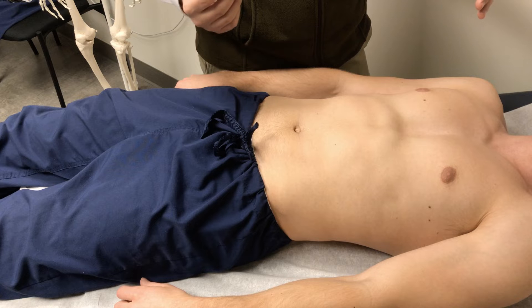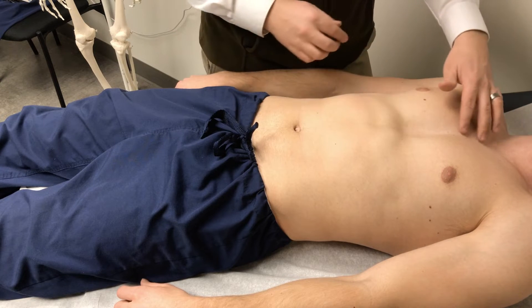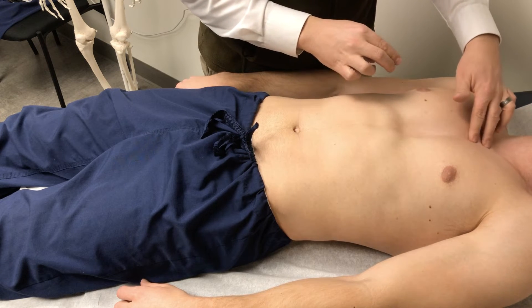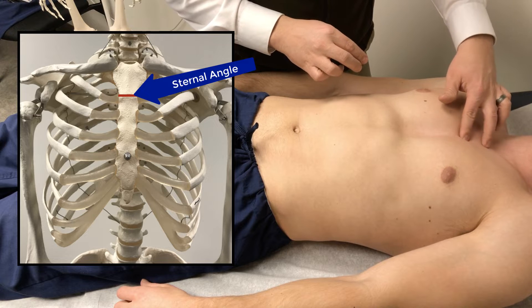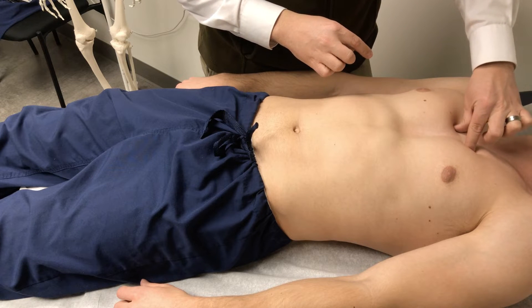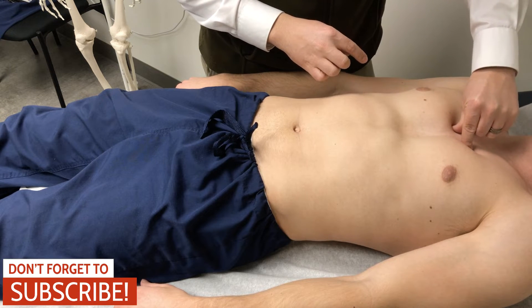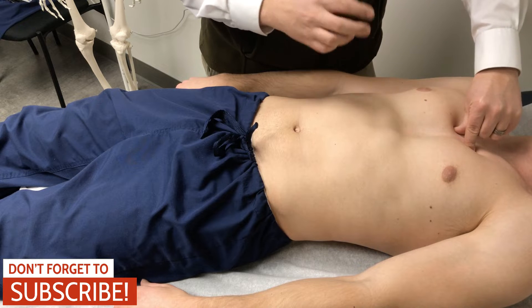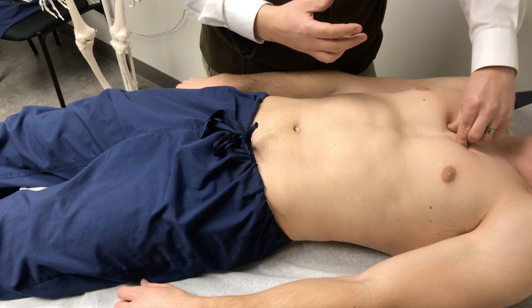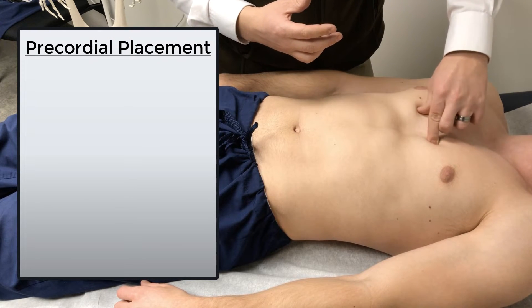Like I had demonstrated on our skeleton, we want to find the fourth intercostal space. On a patient, we want to first find their sternum — the body of the sternum here, manubrium at the top. We want to find that sternal ridge that exists between the manubrium and the body of the sternum. Once you feel that, off to the side you're going to find ribs at that same level. Once you find that rib, that's the second rib, and the inner space just below it is the second intercostal space. We want V1 and V2 electrodes in the fourth intercostal space, so we slide down further: third rib, third intercostal space, fourth rib, and then the fourth intercostal space.